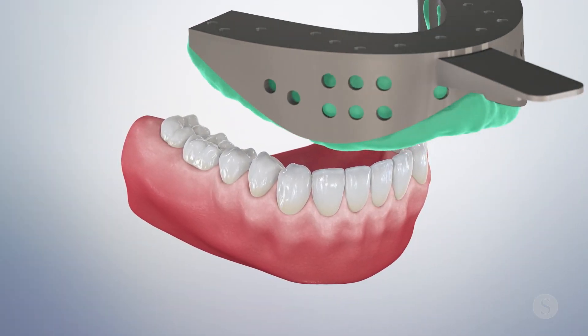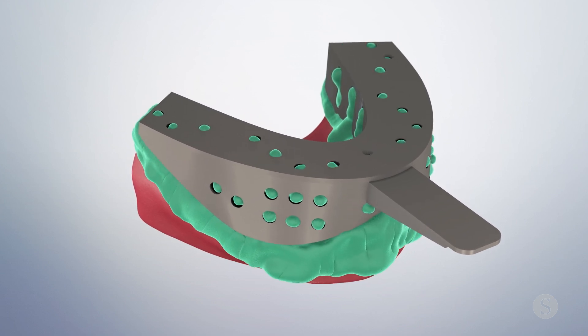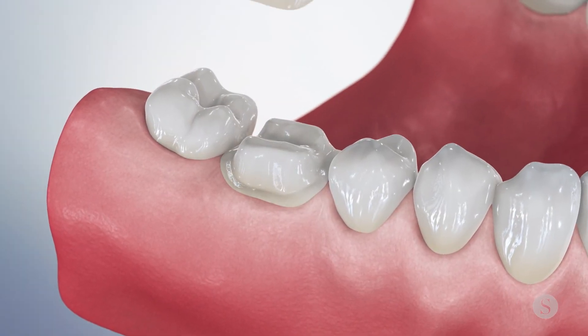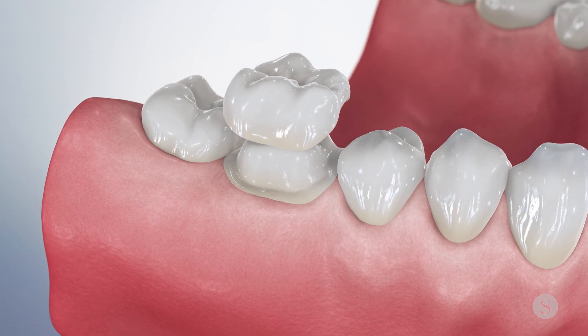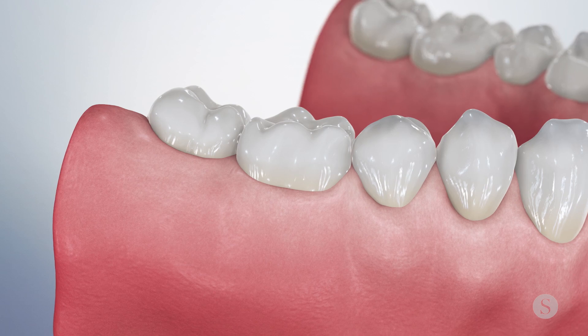If the crown is fabricated in the analog world, I recommend a full arch impression instead of a partial one. Also, during crown delivery, make sure to check that it feels like a natural tooth as the patient reaches into maximum intercuspation.